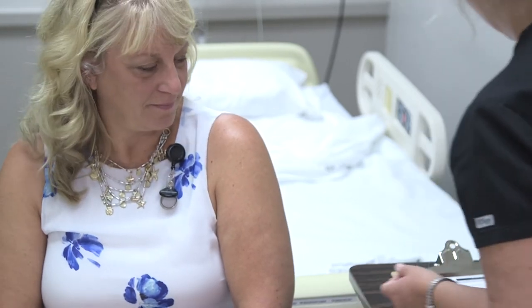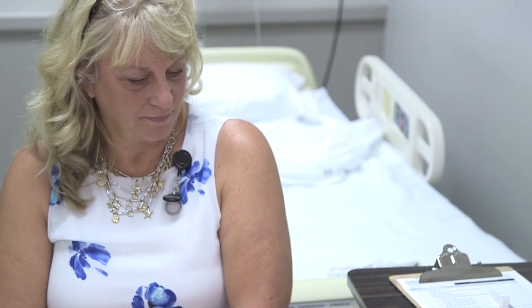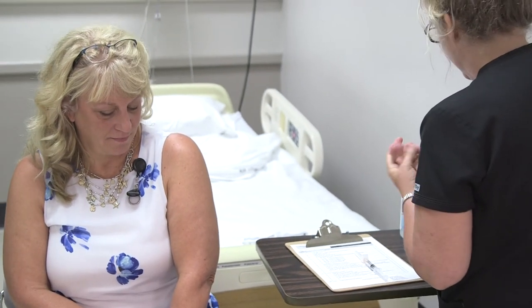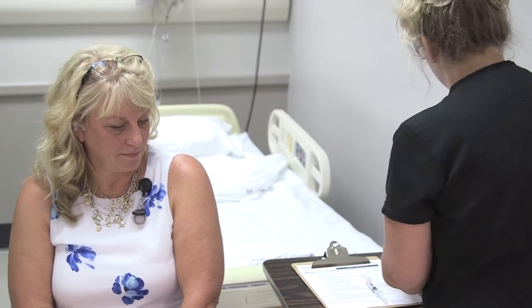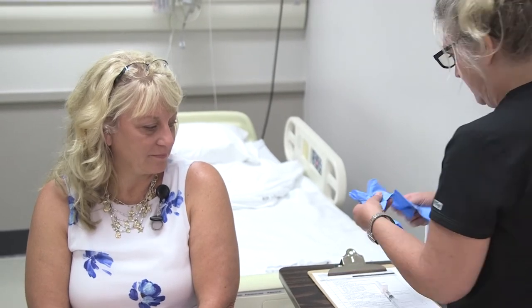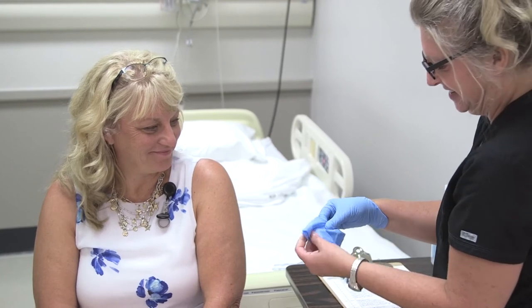Very good. All right, so I'm just going to wash my hands again before I put my gloves on. I do recommend gloves because sometimes the patient might bleed afterwards. It's good to have a gauze with you or an alcohol pad afterwards in case they do bleed, and a Band-Aid as well, which I don't have. I really should have got that. All right.